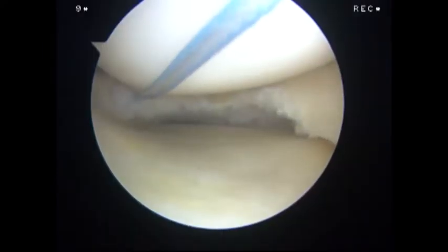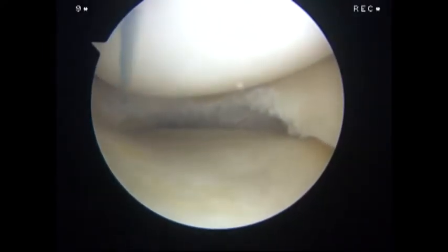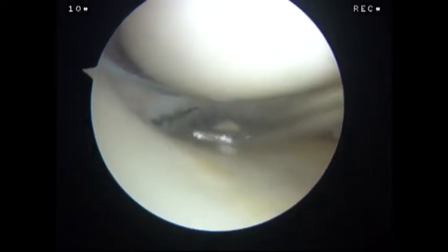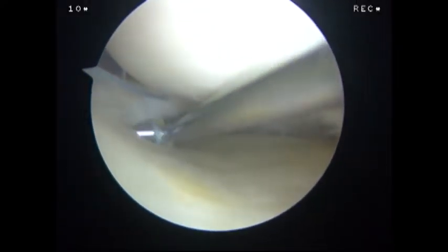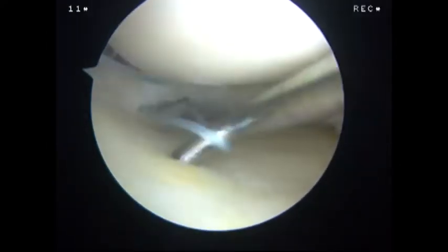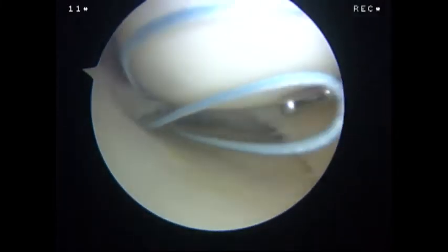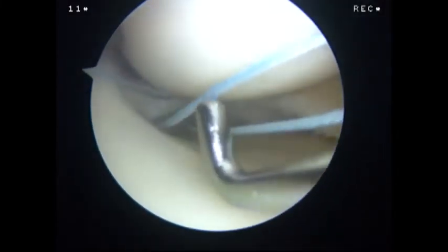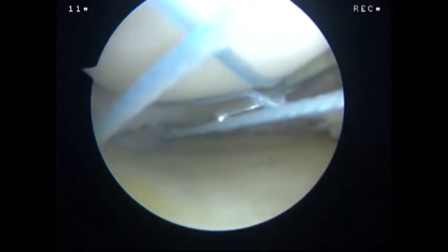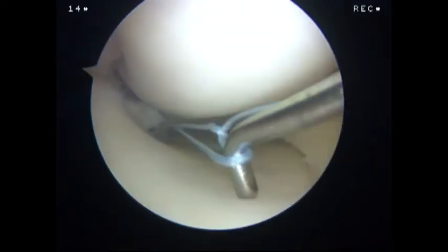The tip of the needle initially penetrates the superior part of the tear. We grasp the suture and bring it out through the anterior medial portal. After that, we pull the needle back until the level of the red zone of the meniscus, and then we penetrate the inferior part of the tear. This maneuver creates a loop, and we pass the free end of the suture through the loop with a probe or with a suture grasper.